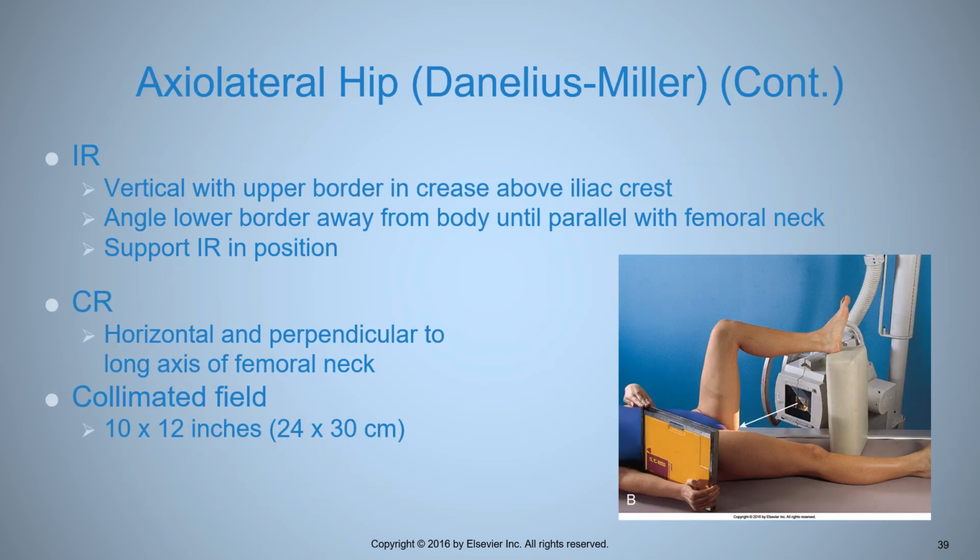So I always think it's kind of silly to include manipulation of the leg instructions on a cross table. The whole reason you're doing a cross table hip is because you suspect it's fractured. You need to flex the unaffected leg 90 degrees and rest the foot and heel of the patient on a support type device. It's got to be like a foam sponge.